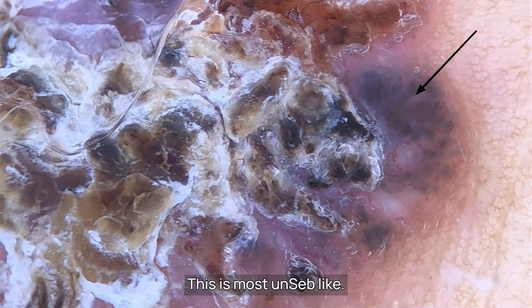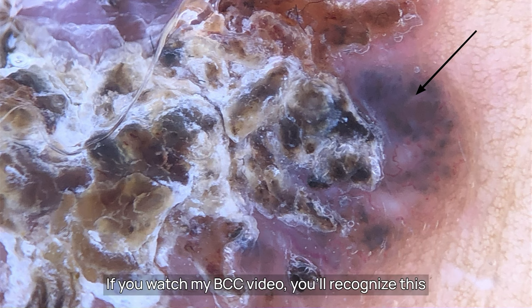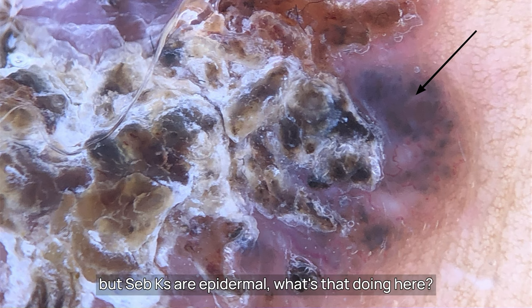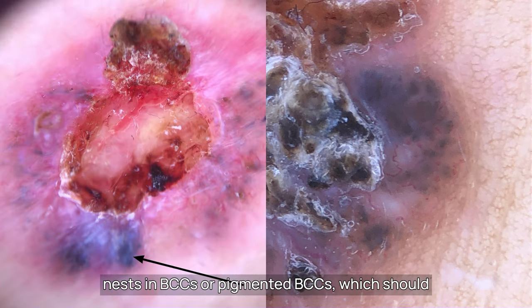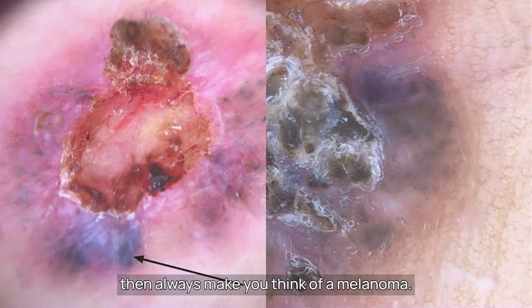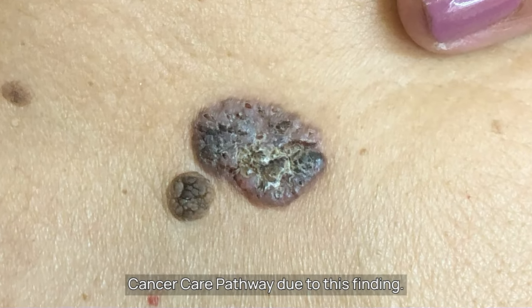Then I came to this three o'clock section. This is most un-Seb-like. If you watch my BCC video you'll recognise this blue-grey colour suggesting melanin in the dermis. But Seb Ks are epidermal — what's that doing here? It reminded me of the blue-grey globules or ovoid nests in BCCs, or pigmented BCCs, which should always make you think of a melanoma. I decided it needed cutting out on a two-week wait cancer care pathway due to this finding.